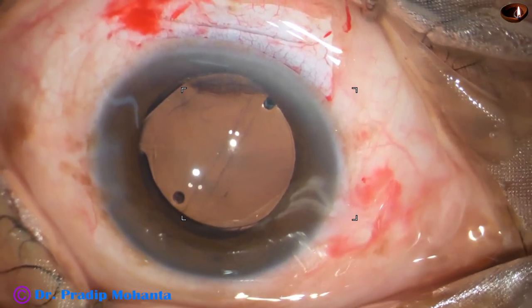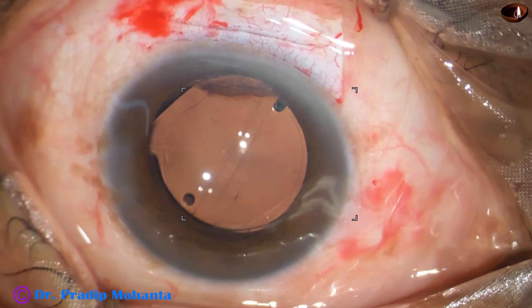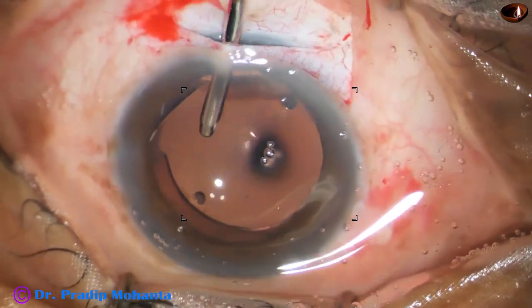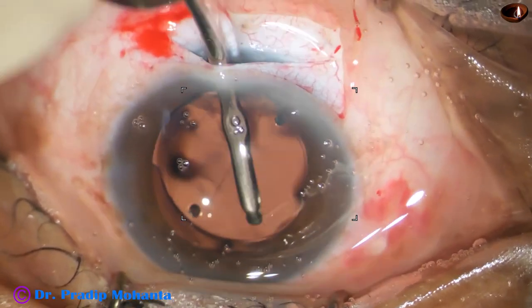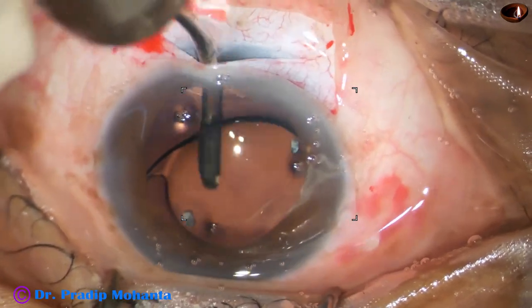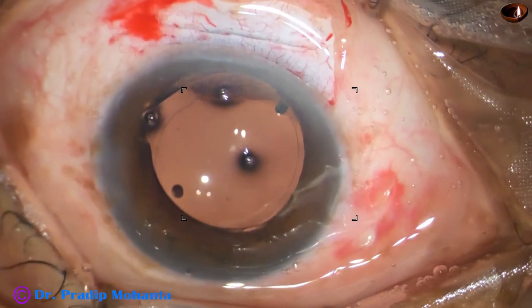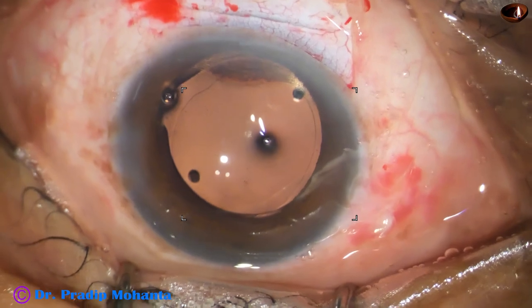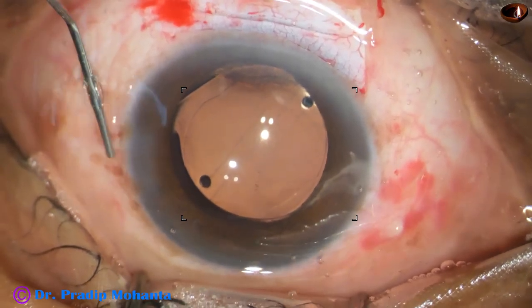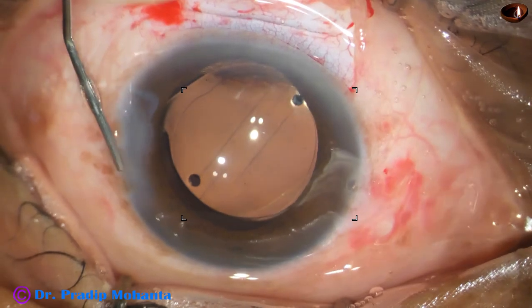The irrigating probe of bimanual irrigation-aspiration is used for further irrigation to remove all visco from the capsular bag. The posterior capsule is polished with the irrigating probe at the same time. Moxifloxacin is used, and the corneal stroma on either side of the side port is hydrated so that the side port becomes sealed.